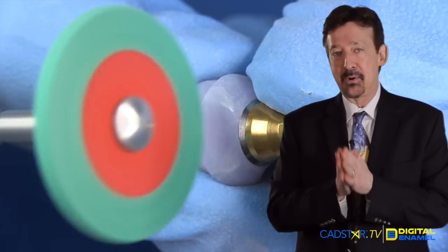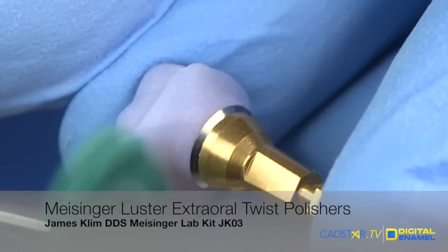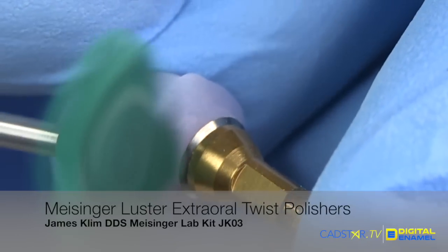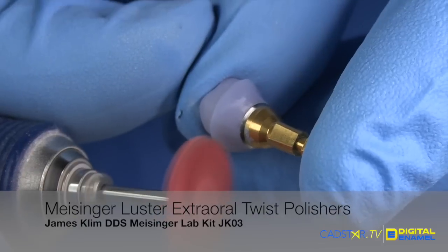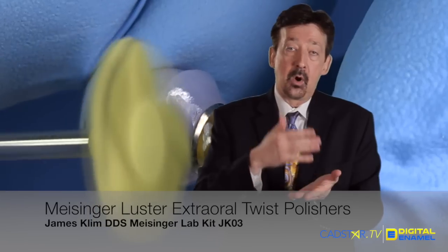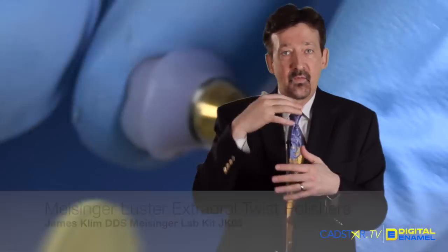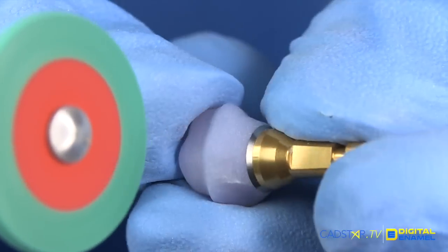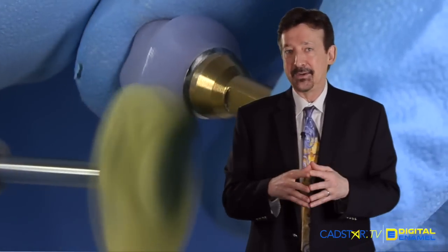This series of videos will document a new system that I'm using on the JK03 Meisinger Lab kit. I really like their polishing knife edge wheels. They've come out with what we call twist polishers. There's the same grit of colors that you would see on the coarse and the medium and the high luster knife edge polishers. In essence, we're using them almost like a Robeson wheel with a diamond paste. So you're going to do most of your finishing with the green and blue knife edge, and then we'll move right in to the twist for the abutment. Let's go ahead and get started with this process.